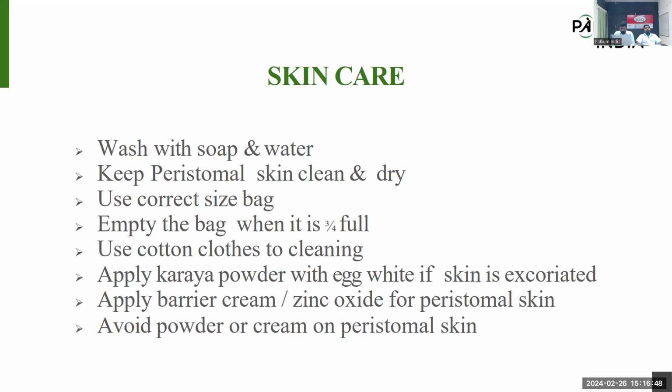Then we can apply the barrier cream also. With the colostomy bag, we can get the barrier cream. If it is available, we can use the barrier cream. Zinc oxide can also be applied as a substitute for the Karaya powder on the excoriated peristomal skin.